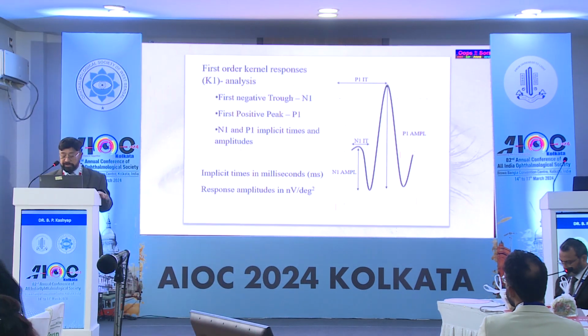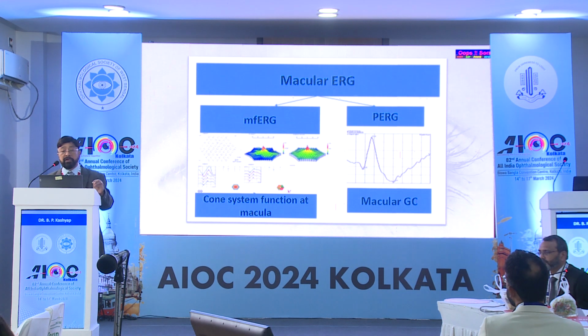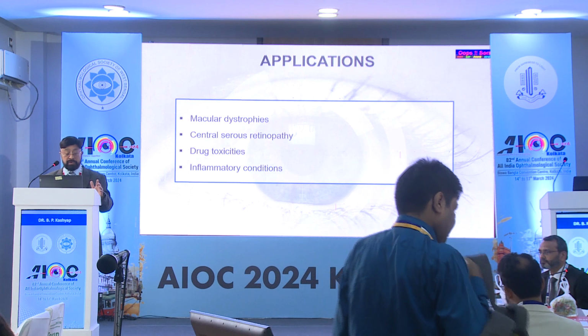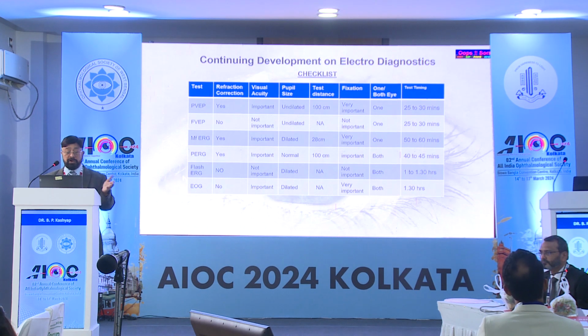As I told you, it is all the summation of these waves. There is a difference between the multifocal ERG and pattern ERG. The multifocal ERG basically consists of the function of the macula, and pattern ERG is basically the macular ganglion cells. Dr. Vibhuti Kashyap will be talking about it in detail. We do it for macular dystrophies, central serous retinopathy, drug toxicity, inflammatory conditions. Dr. Vibhuti has already talked about all these.